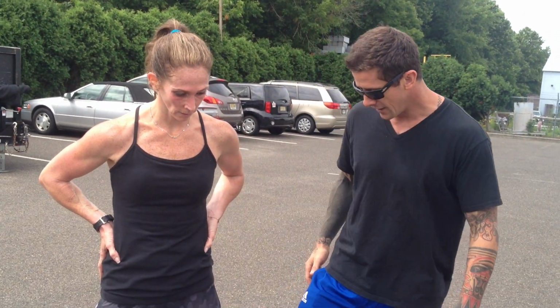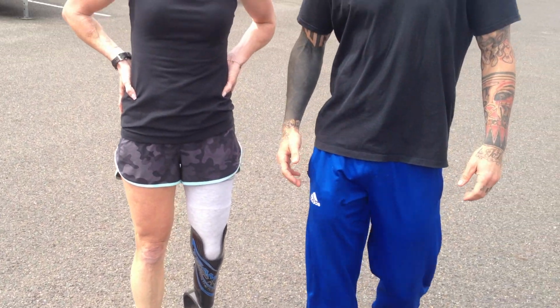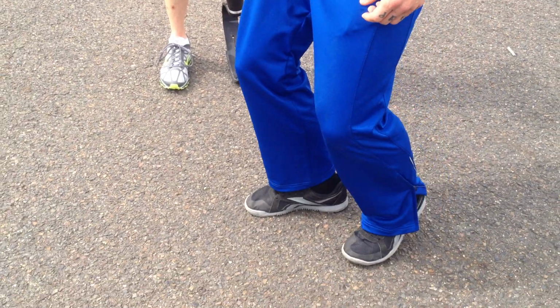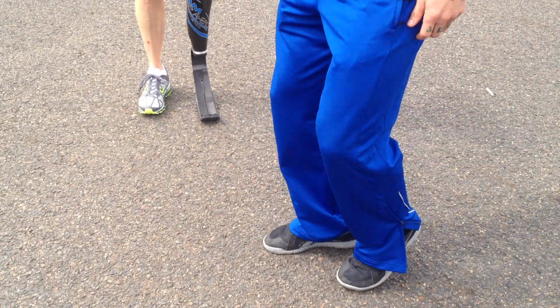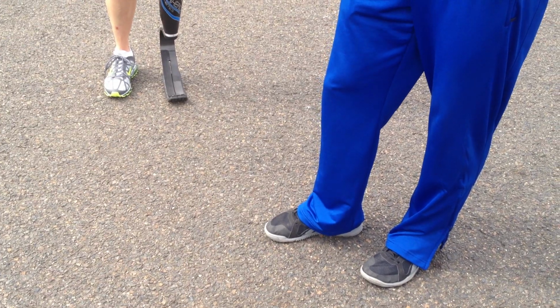So for somebody who's going to go roughly 135 miles through the desert heat, we want to find the most optimal way for her to get across that desert, or even for you, who does not have the use of such a kick-ass little leg that's going to allow her more freedom and less energy expenditure because of the way that it's designed. So when we land on that heel, we actually have to roll through and produce more force or muscle contraction in order to make up for what we could be doing with less muscle contraction and more muscle tendon elasticity. So it's kind of a cool little tool for a cool little athlete, and we're just happy we could help.